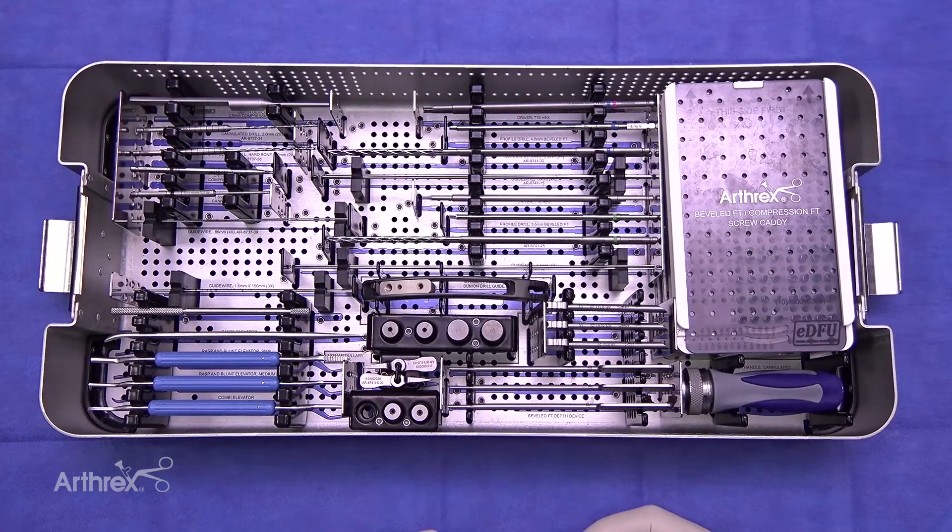This is Dr. Noman Siddiqui from Baltimore, Maryland, and I'm very excited to demonstrate the Arthrex minimally invasive bunionectomy and the new dedicated system to perform the osteotomy, correction, and screw placement accurately within one set.